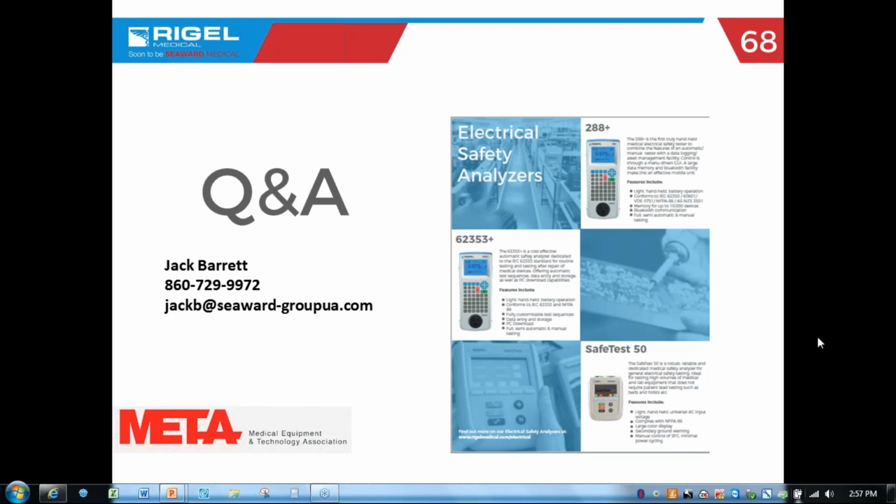Okay, that's great. Now you discussed Class 1 and Class 2. What does Class 3 refer to? NFPA 99 doesn't talk about Class 3. They do talk now in 2018 about testing at the voltage the product is being designed for, which makes a lot of sense for 120 volt operation. Class 3, you'll start to see it pop up in some different journals and such, and it really just refers to low voltage DC operated product.